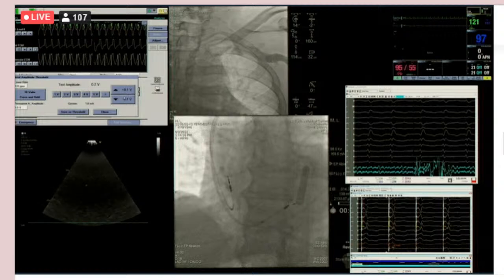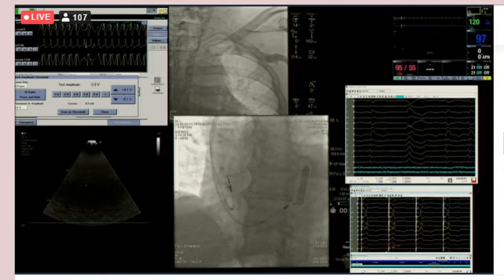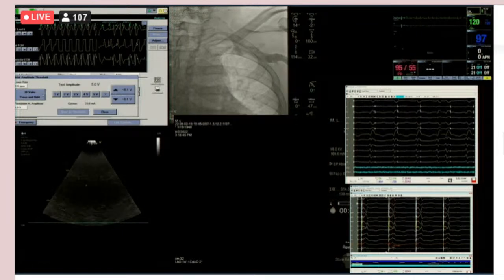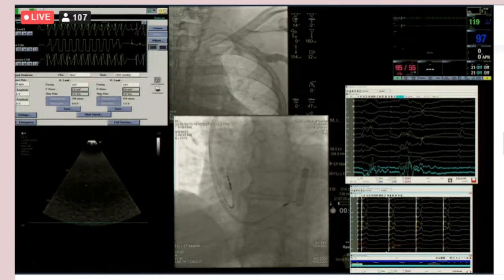Yeah, I'm not saying I'm that progressive yet. I still would like to see larger randomized trials that directly compare left bundle pacing and CRT, because we know CRT works in a good percentage of patients. But I suspect you're right, to be perfectly honest. It's too tempting when you get super narrow QRSs.